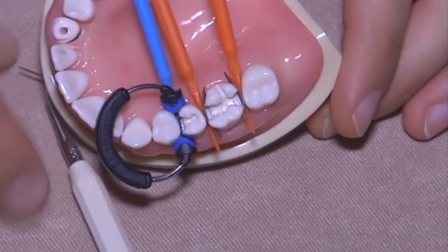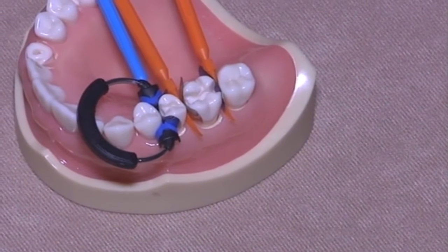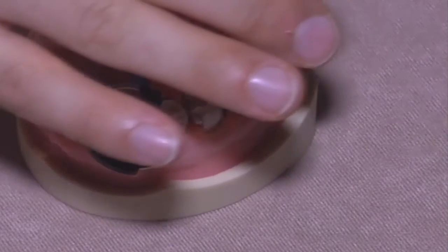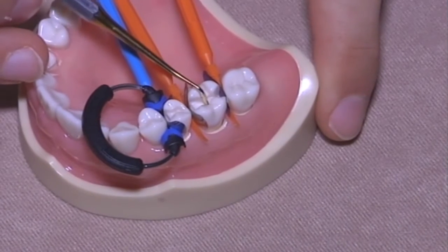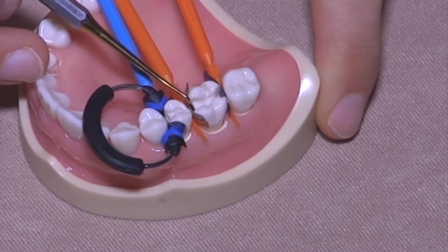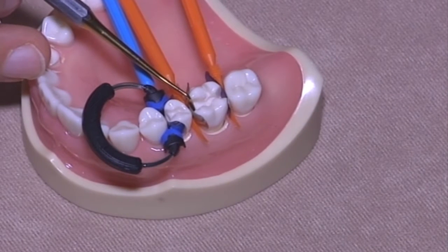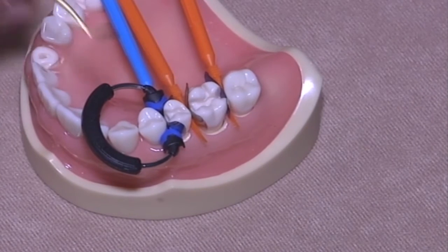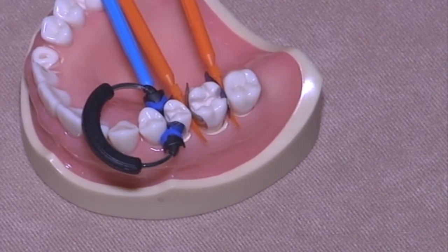Okay, we're gonna start with the premolar. In these cases, the other suggestion I can give to you is to immediately perform the adhesive procedures on both the cavities, because if you are going to do first here and then here, and if you perform the adhesive system here, leaving this cavity with dentin drilled, exposed but not etched and not with adhesives, this collagen will collapse and this tooth will be a lot dehydrated, and so you could have a lot of problems of post-op sensitivity.